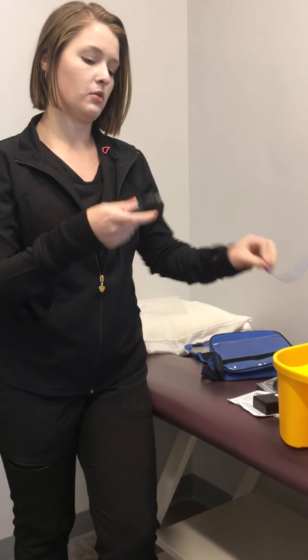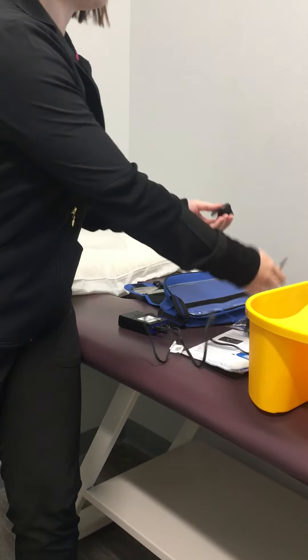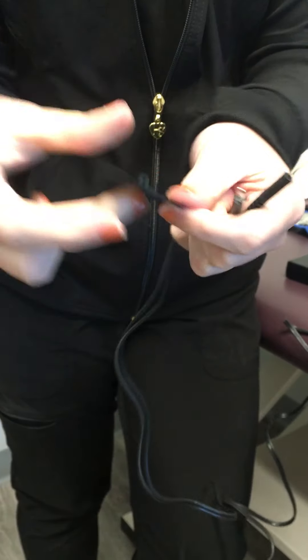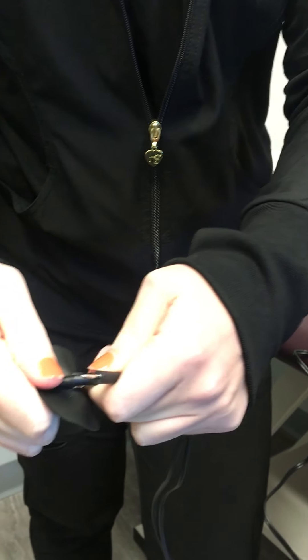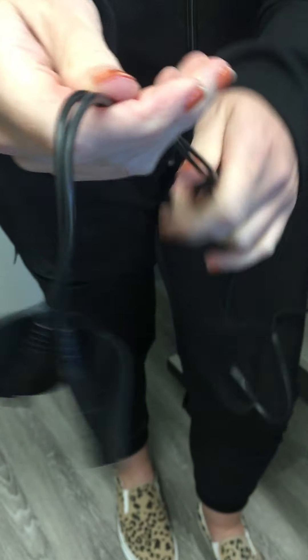First thing you're going to do, you're going to put the unit together. We have some lead wires for you just like so. They plug in right on the top, and then what you will look for are these two plastic black pads. On each end of the lead wire you will slide these on until they're completely connected, just like this.